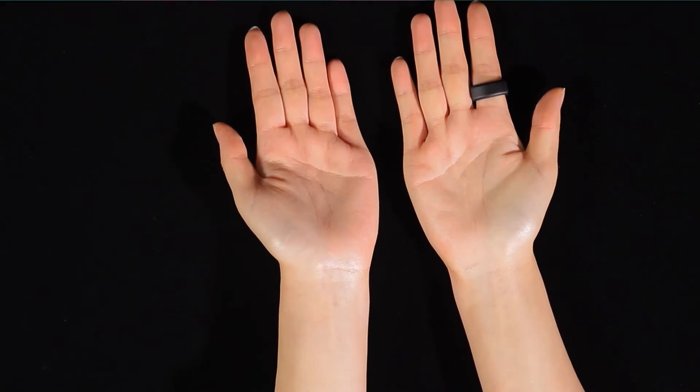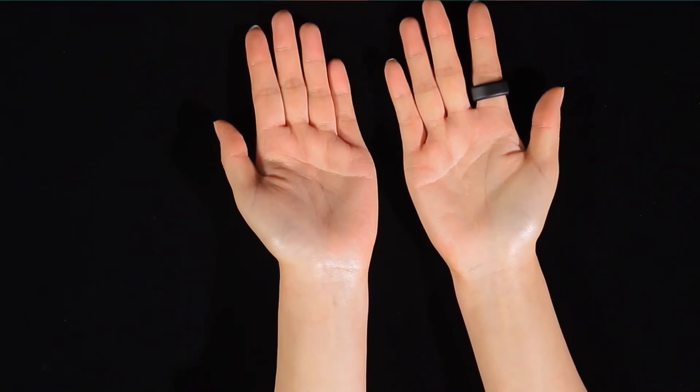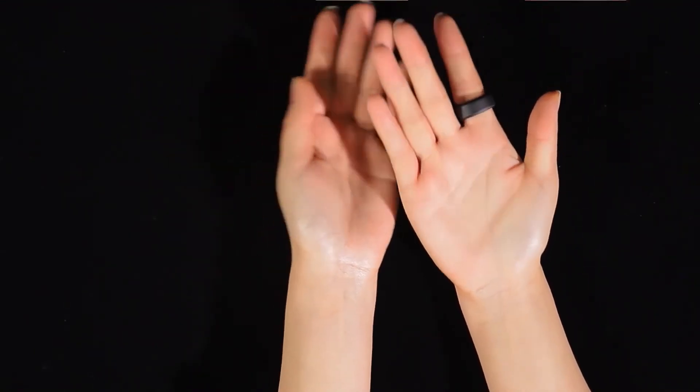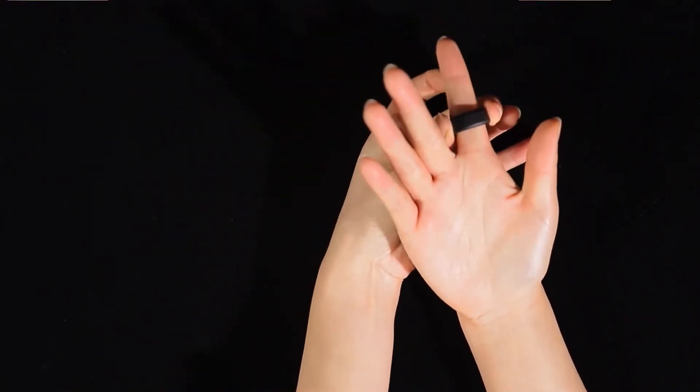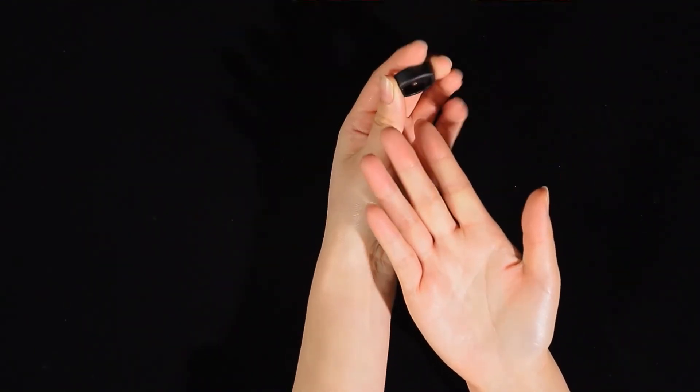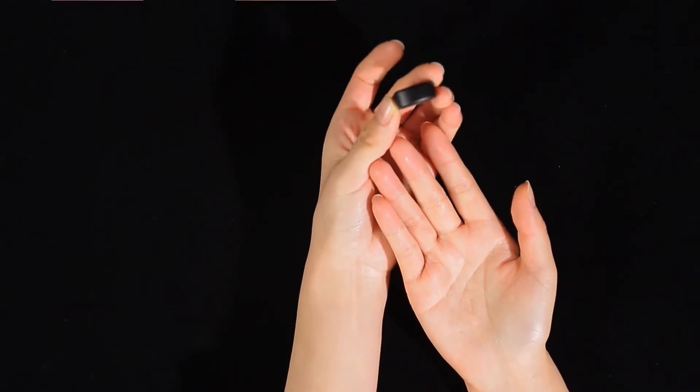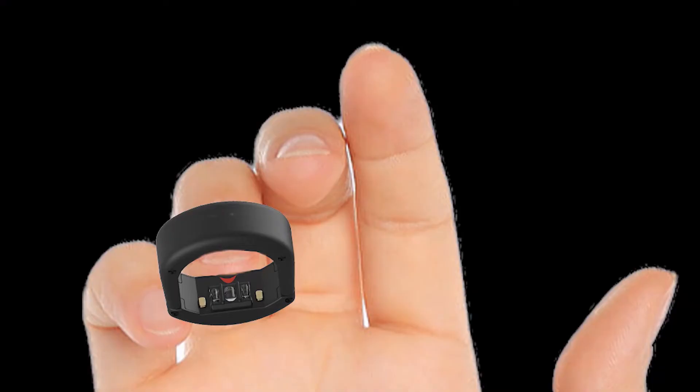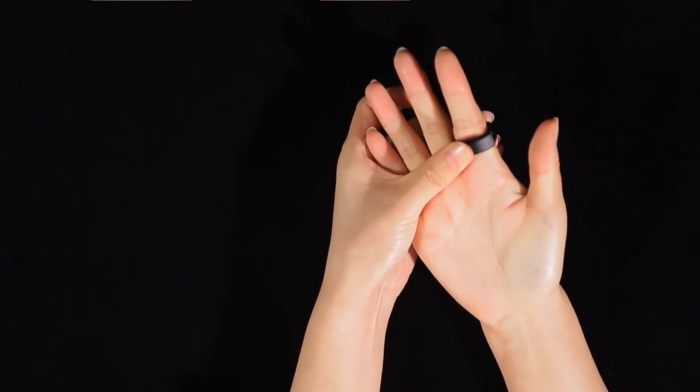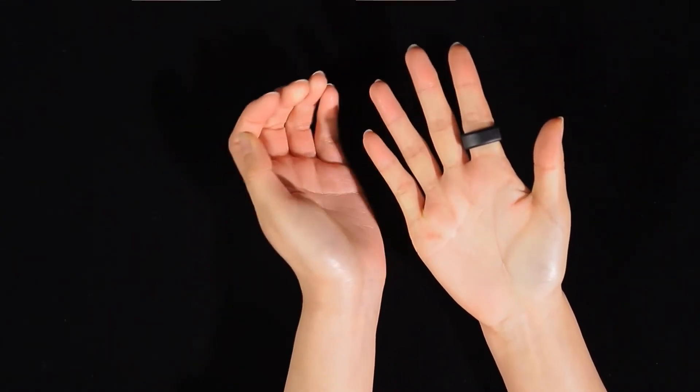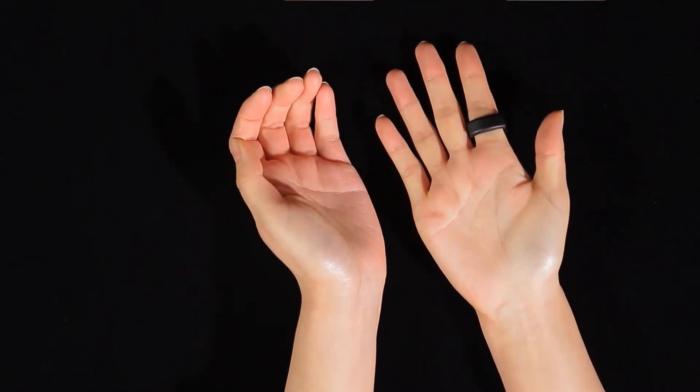Let's show you how to wear your ring properly. Select the appropriate finger of your hand to wear the ring. Wear the ring snugly and not too loose. Slide your finger into the ring in the direction of the red arrow.